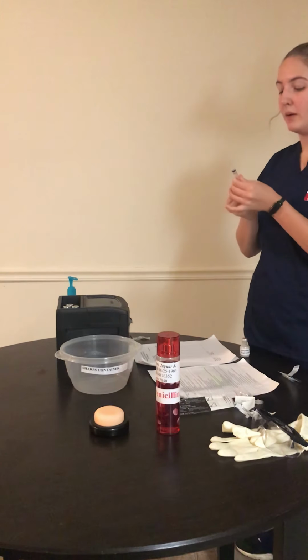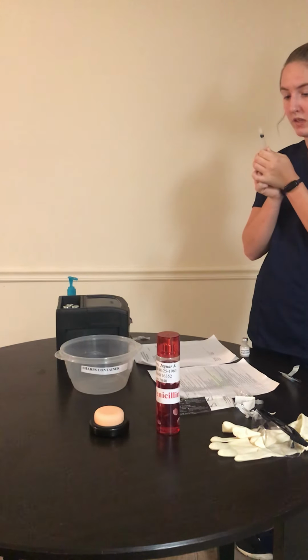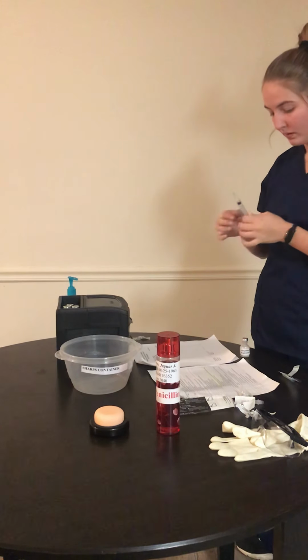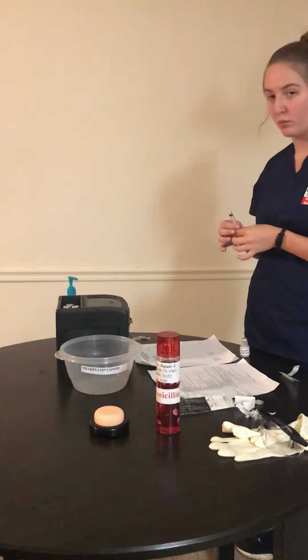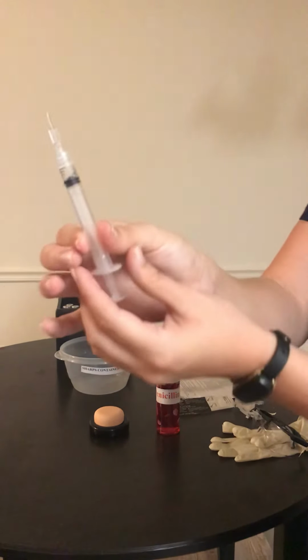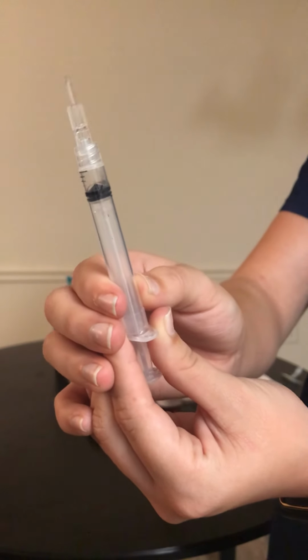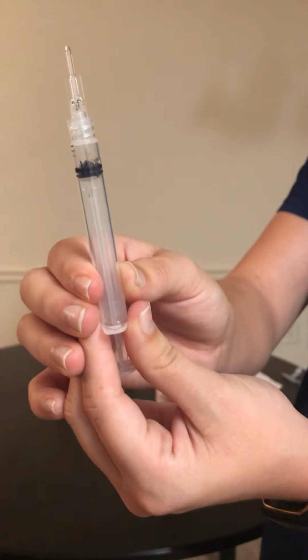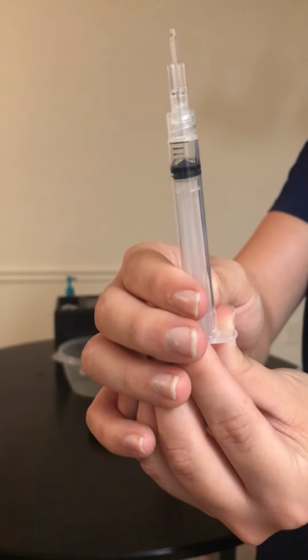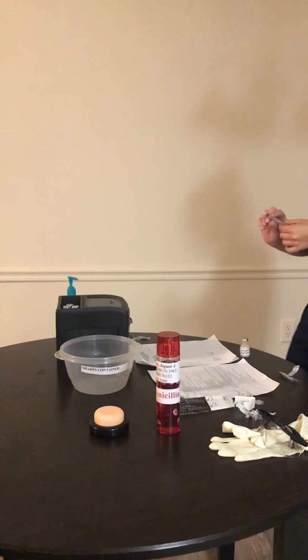I am then going to aspirate half a milliliter since that is what I need to get 5 milligrams of morphine sulfate. So I have aspirated half a milliliter and now I will withdraw my solution.